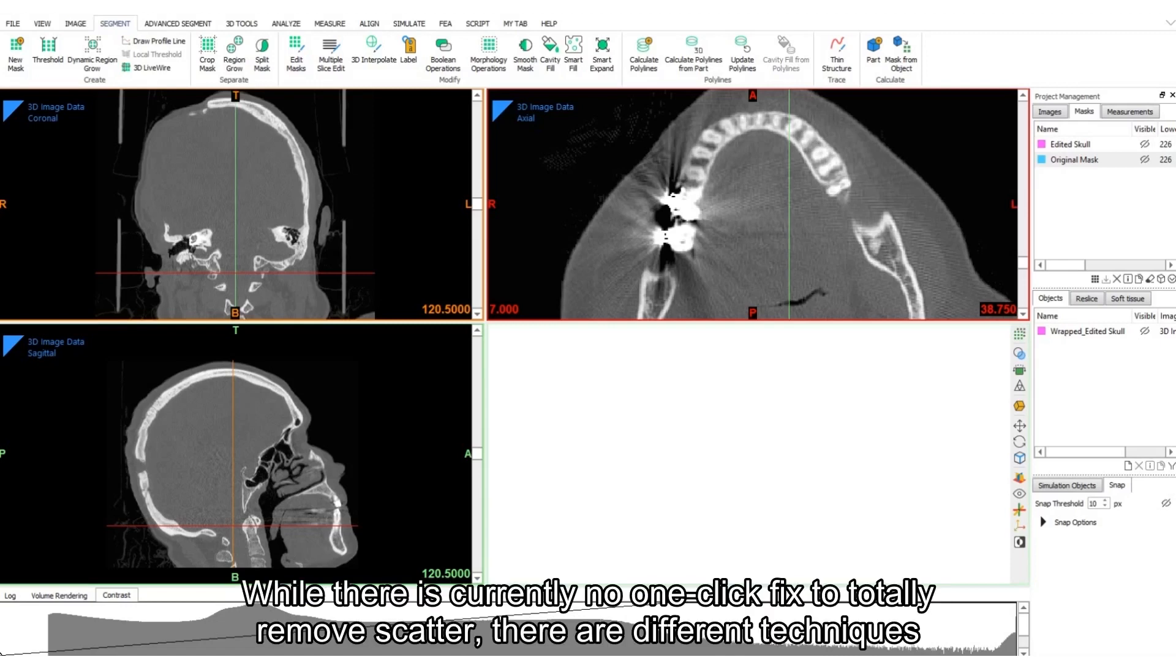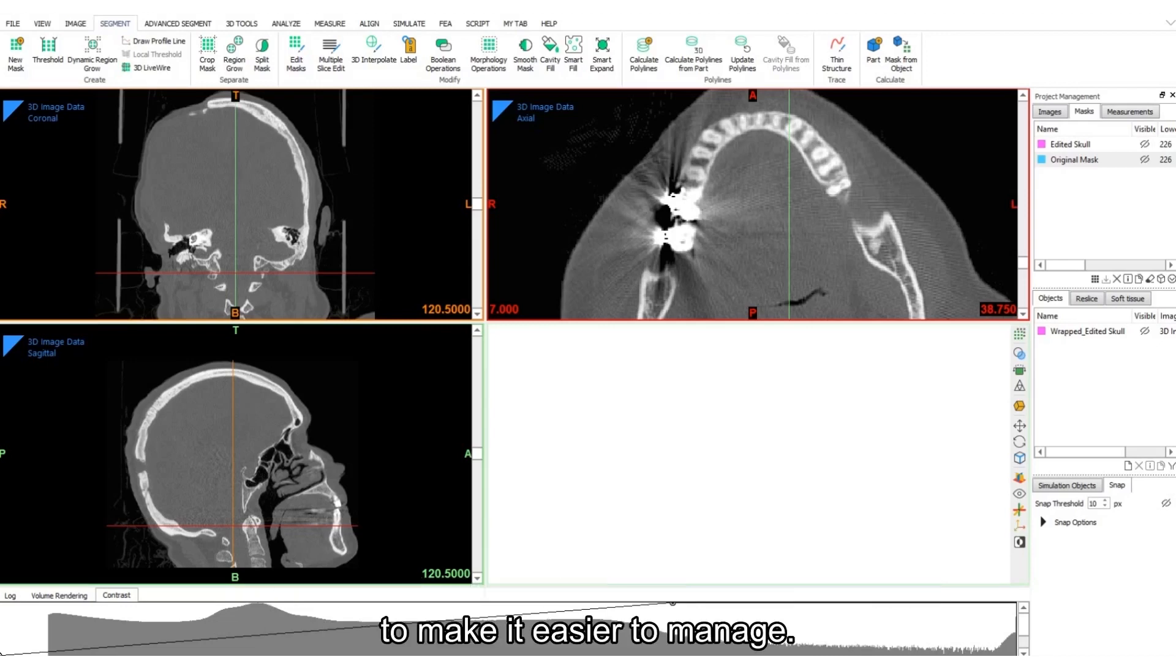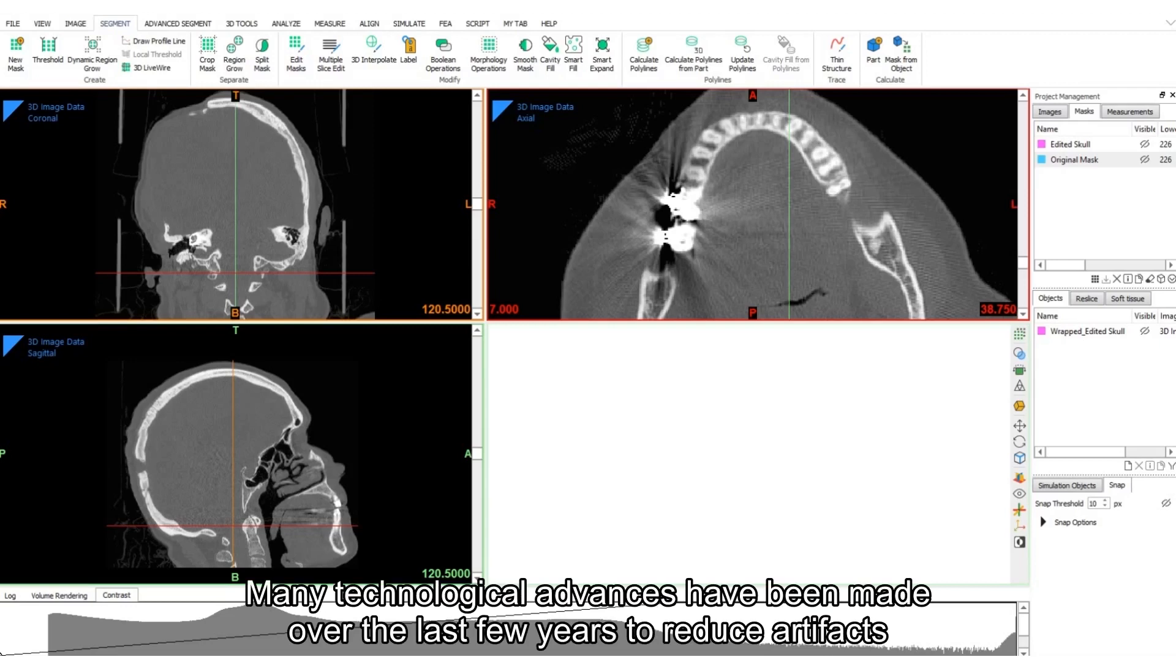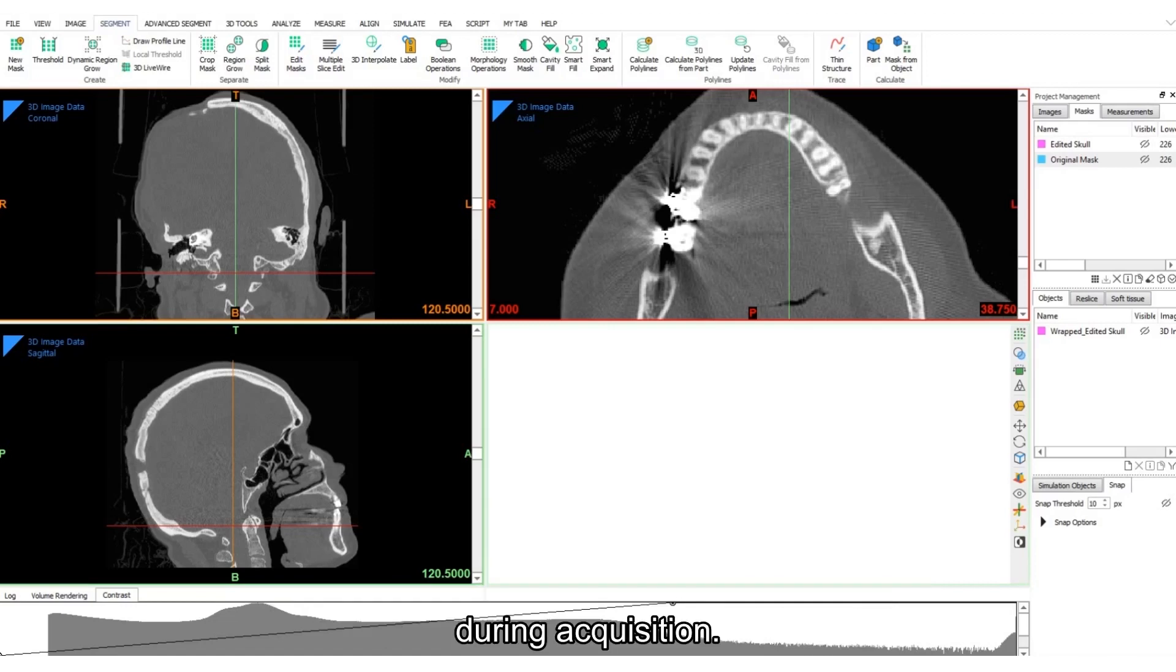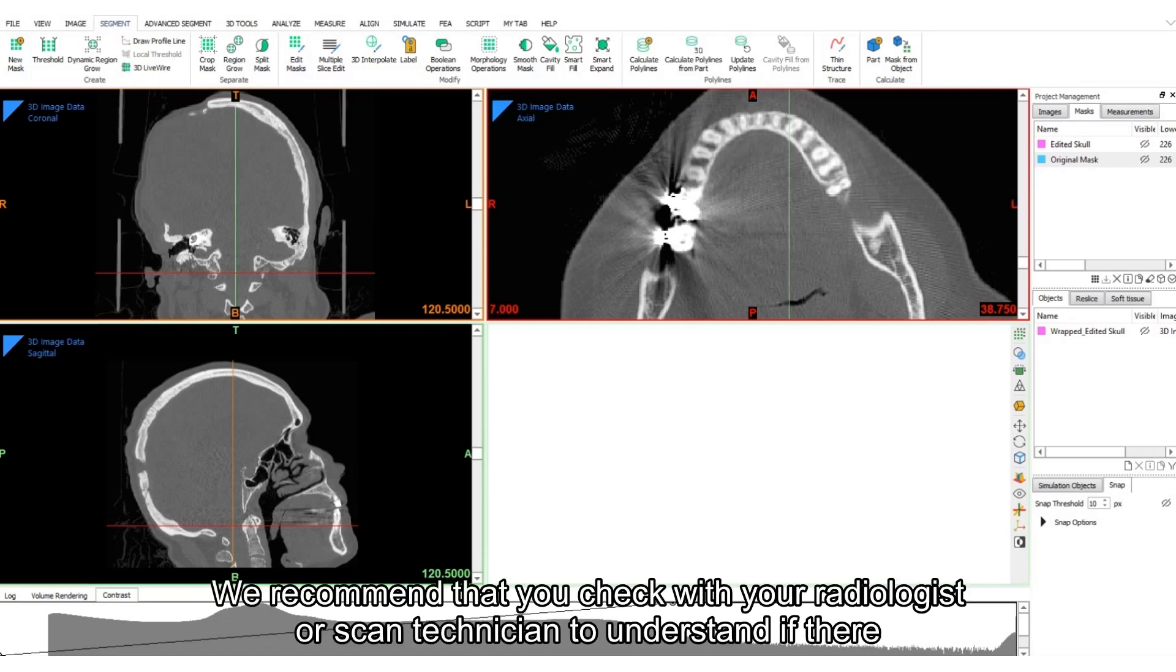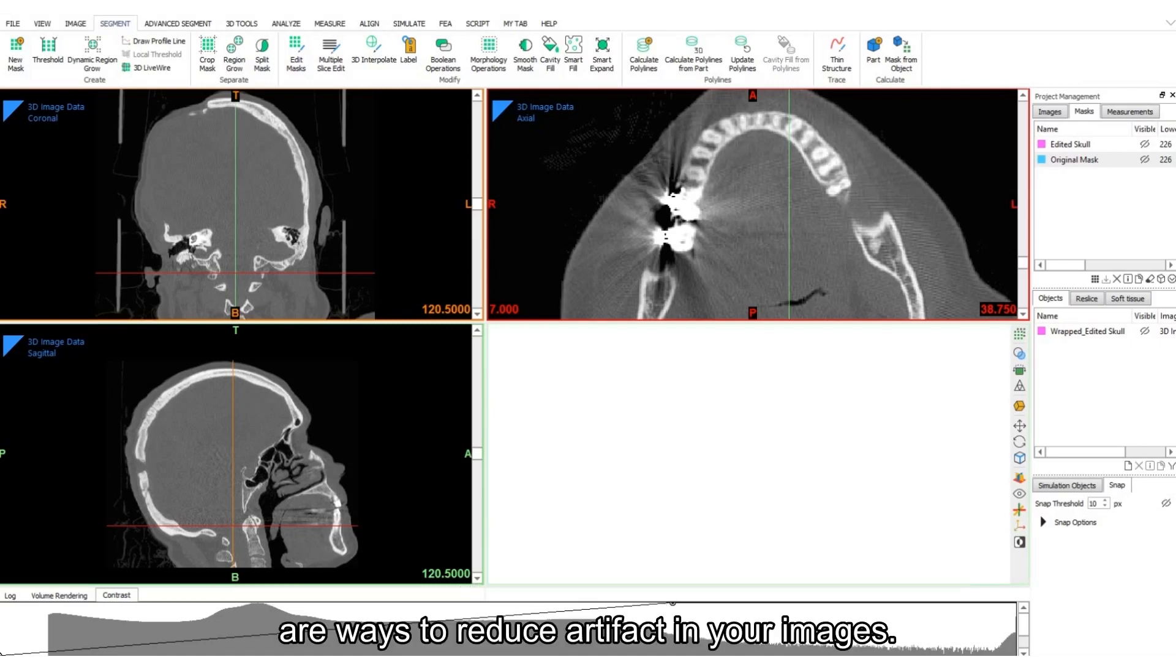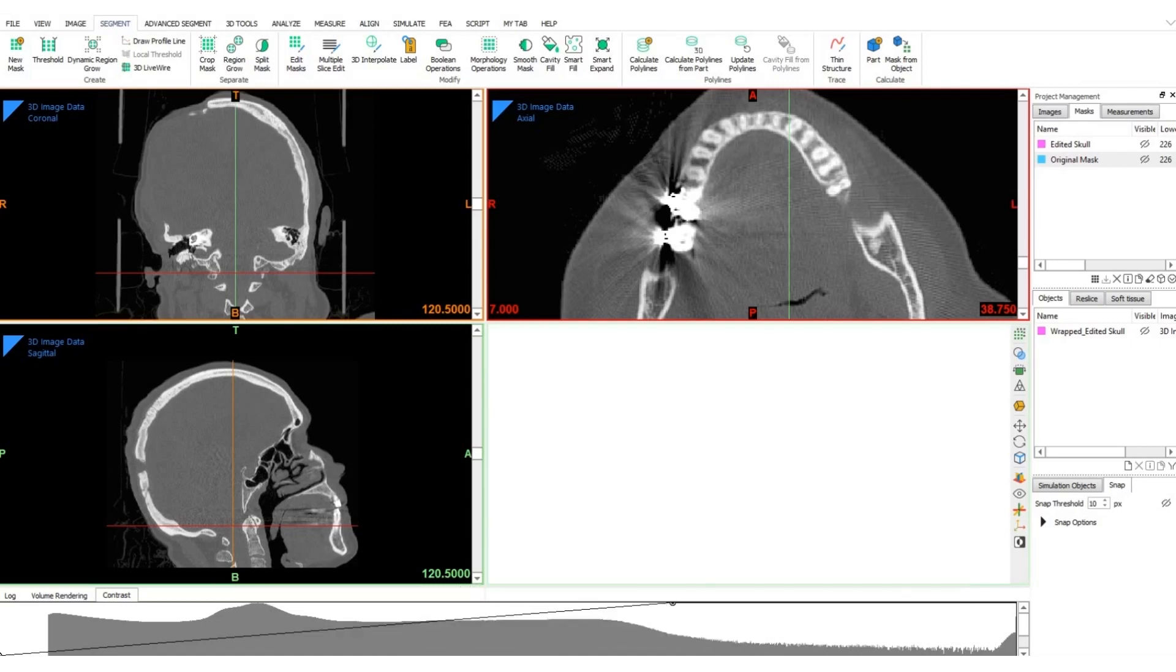While there is currently no one-click fix to totally remove scatter, there are different techniques to make it easier to manage. The first way to deal with scatter is during image acquisition and reconstruction. Many technological advances have been made over the last few years to reduce artifacts during acquisition. We recommend that you check with your radiologist or scan technician to understand if there are ways to reduce artifact in your images.